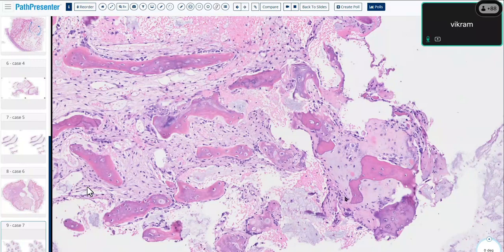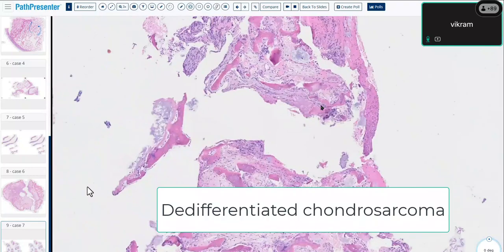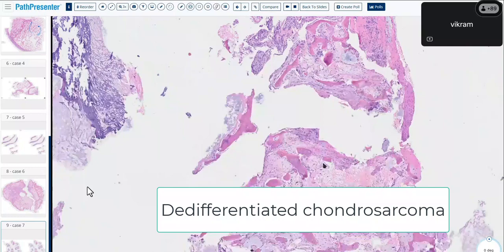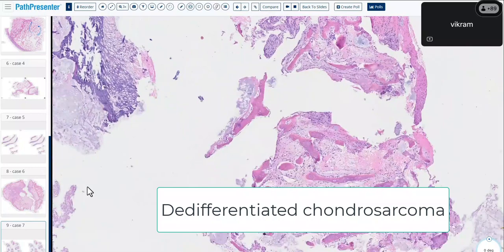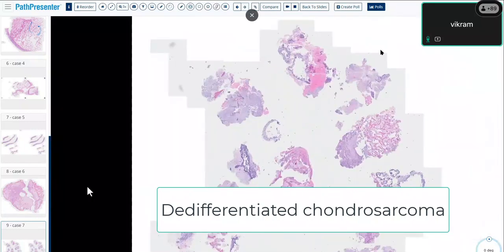We had a paper many, many years ago. Subsequently, there have been a lot of papers. IDH1 or IDH2 are detected in between 50 and 60% of chondrosarcomas. So the absence doesn't mean a whole lot, but the presence does. All right, so any last minute questions before I hand the podium to Manish?